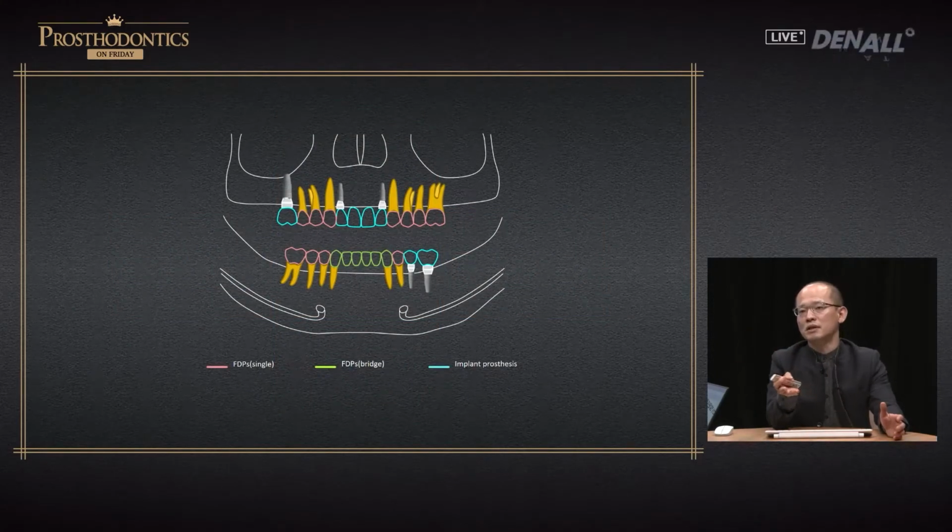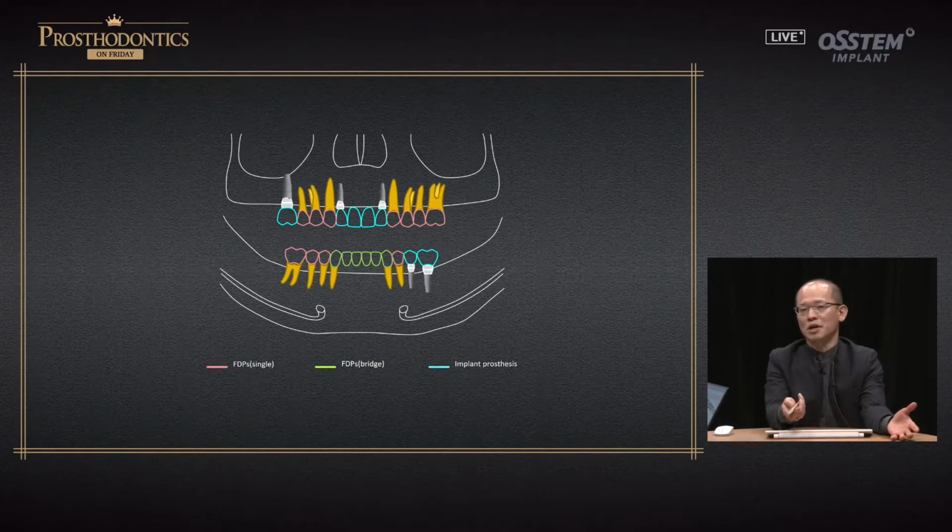So with the implant, this becomes a very simple treatment plan, and there's a sectional bridge, and you can have a full mouth maintenance. So that is the strength of using implants. So that would be the first treatment option.